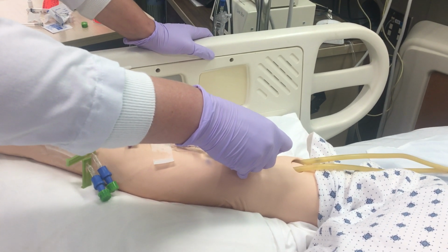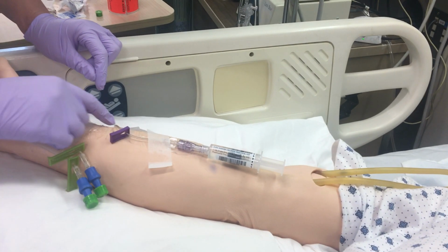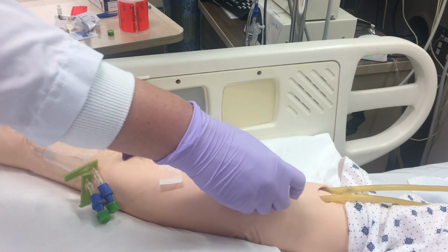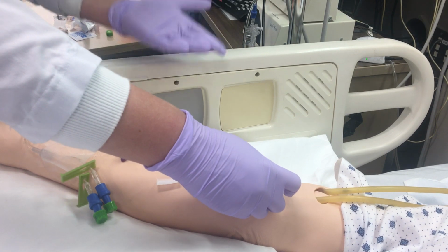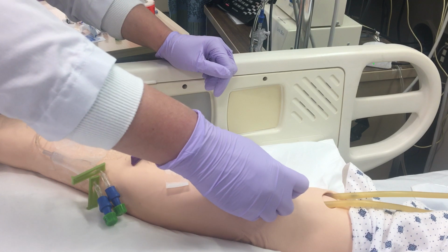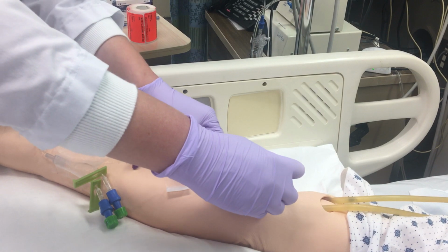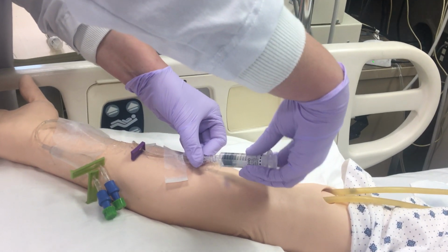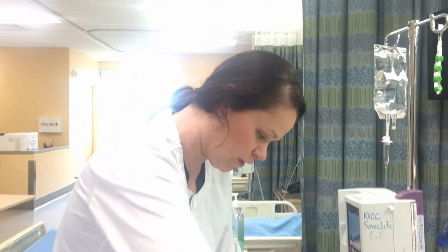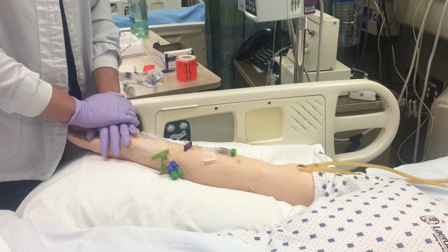The thought behind that 1 minute is the dead space that you can see between the catheter line and the tubing. That's where the medication sits. So to give this flush very fast would mean that the medication is going into the systemic circulation extremely fast, which can cause some potential complications. And that is complete. And at the end, you would place a new chlorhexidine cap on, and that is the completion of the IV push through the peripheral line.